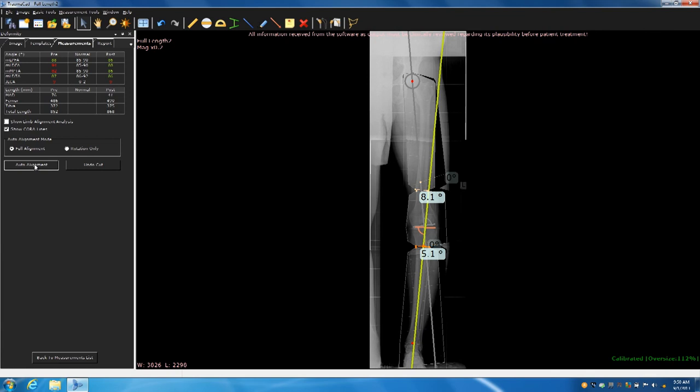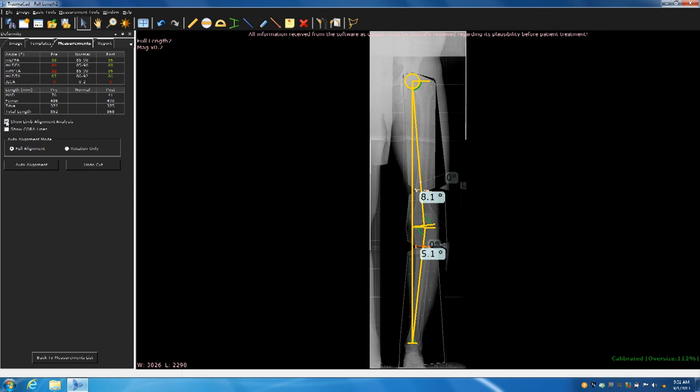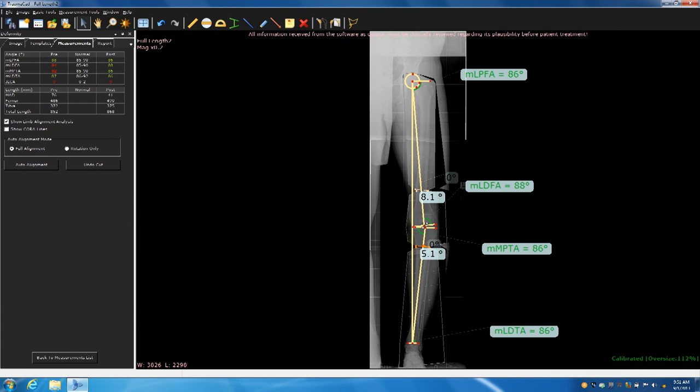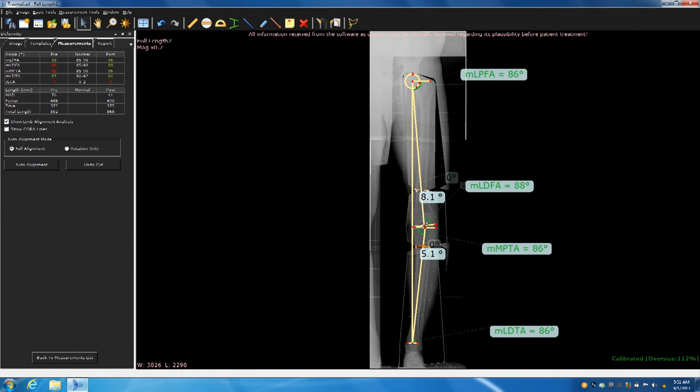So at this point, hit finish and cut. Auto align. Now, if you hide your CORA lines and you look at the leg, you're like, boy, that looks pretty nice. If you do your show alignment lines, you'll see that you're still varus. And that's that joint laxity. Look at your joint congruency angle. That hasn't changed. It will change as the bones correct, but you might find that as he stands up, if your mechanical axis is perfectly in the middle without the joint line congruency, without the joint instability, he still might teeter-totter into varus.